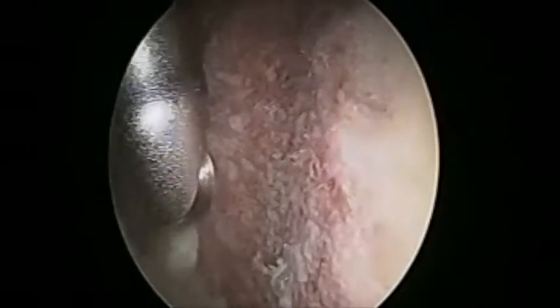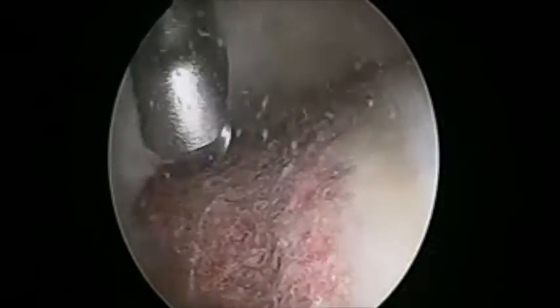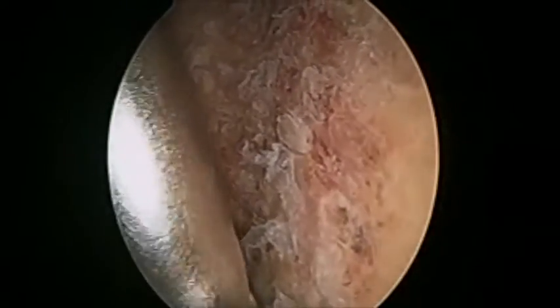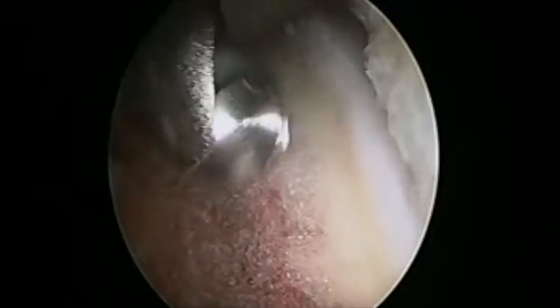Briefly, this begins with Tier 1 to set the depth of resection and attempt to restore head-neck offset. Tier 2, as shown here, then resects the cam distal to the Tier 1 resection. Again, during this period, fluoroscopy is utilized to ensure appropriate resection. After completion of Tier 2, again our attention is turned proximal to the Tier 1 resection with the goal of restoring the sphericity of the head.